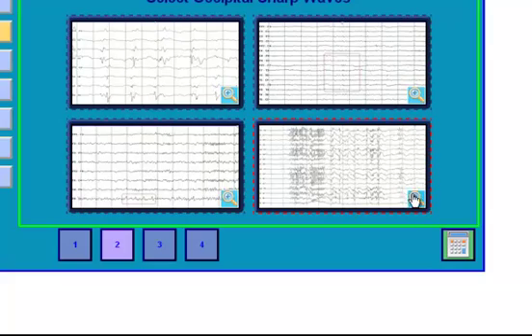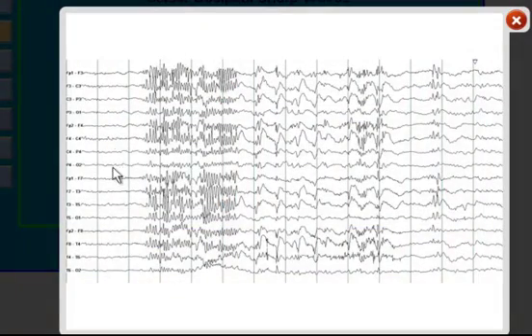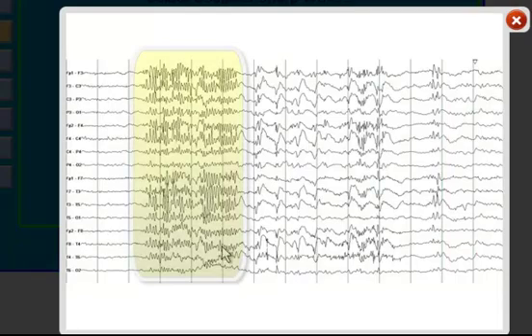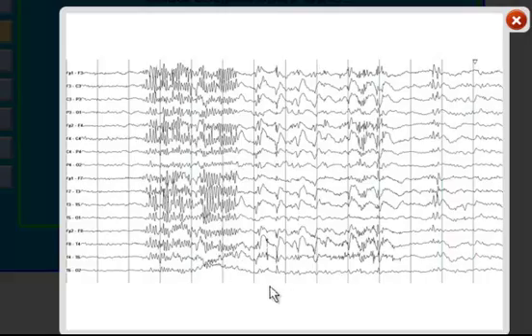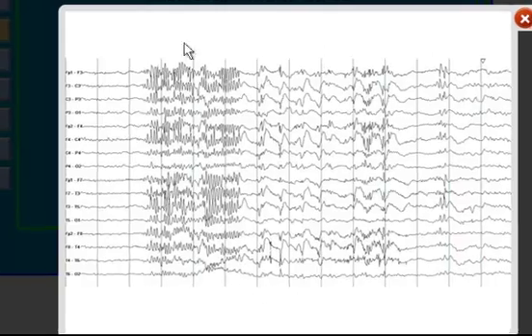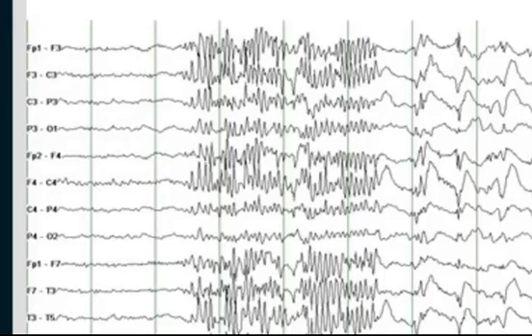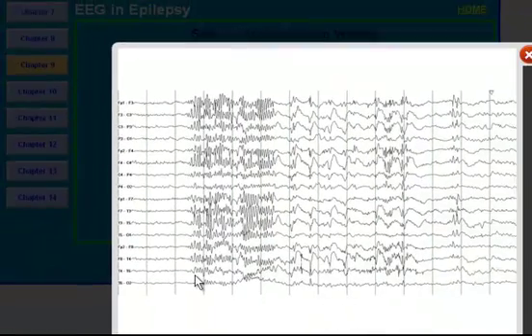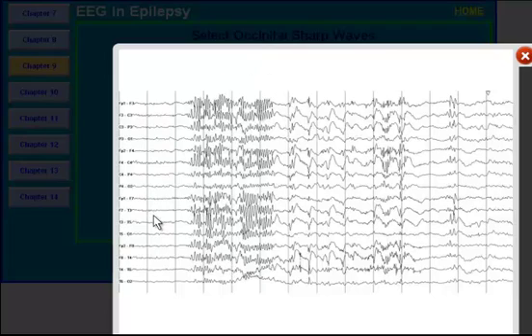What about here? You see a very fast frequency here out of sleep, followed by some slow spike and wave discharges, maybe 1.5 to 2 Hz spike and wave discharge at a slow frequency. This is the fast activity. This is called paroxysmal fast activity, something that you see in patients with Lennox-Gastaut syndrome. In patients with Lennox-Gastaut syndrome during sleep, you may see paroxysmal fast activity.